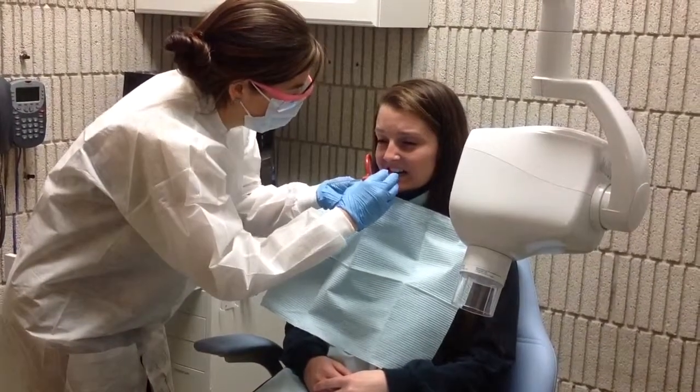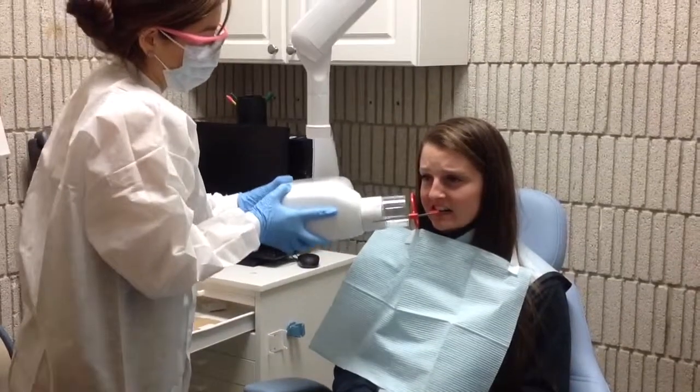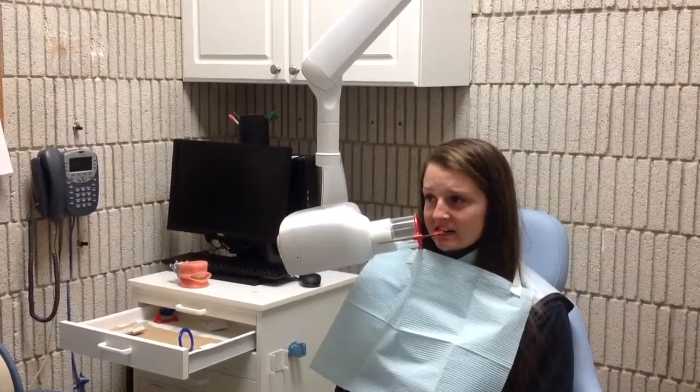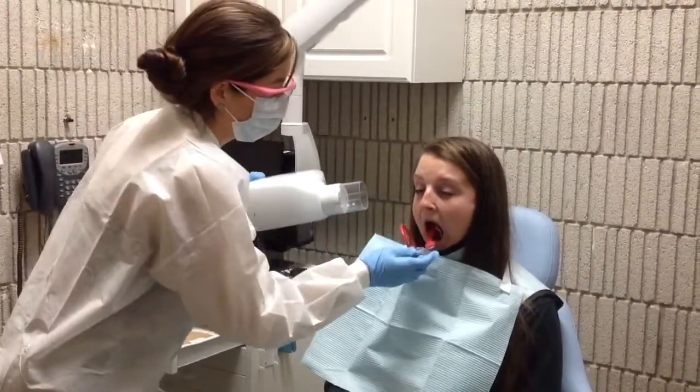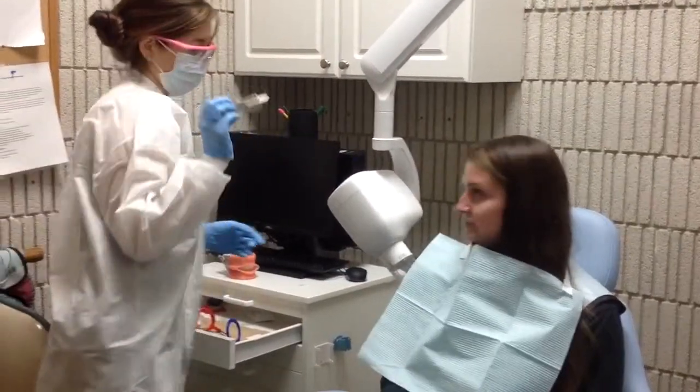Good job. Real quick, stay nice and still. You're doing so good, Erin. Beep. Awesome, go ahead, open. Good job, Erin. All right, and we do have one other thing.